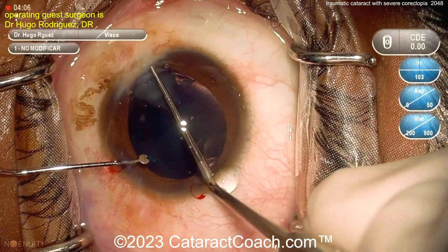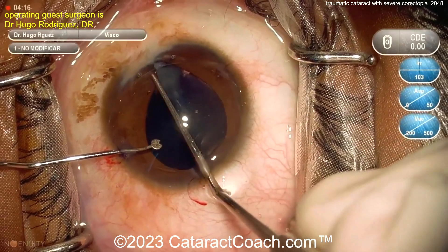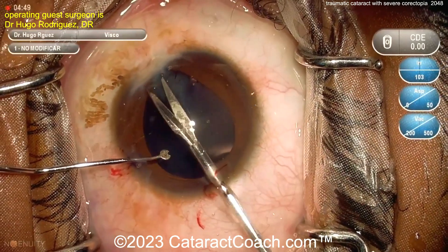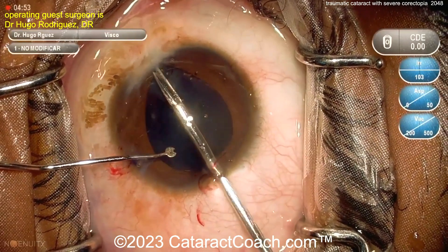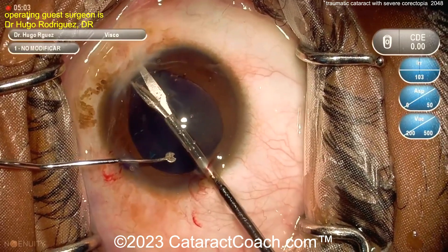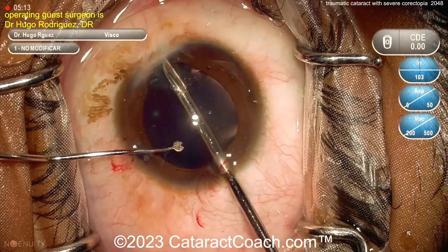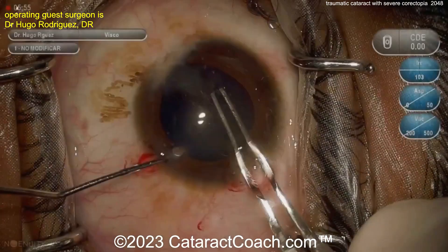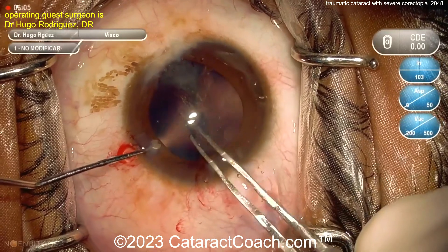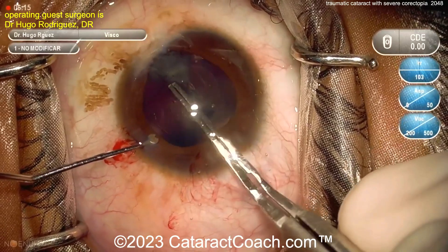The main incision is being made, and now using a Sinskey hook or similar device to free up any iris that's attached. You have to be careful because sometimes that iris is plugging up the damage. You can cut some of the bands, but don't yank too hard — the iris could be plugging a hole at the corneal-limbal junction, fibrosed in place for years. Using micro scissors to cut adhesions instead of ripping them is the smart approach.